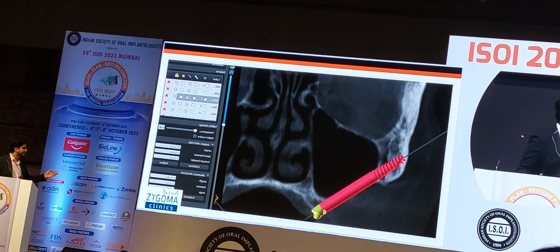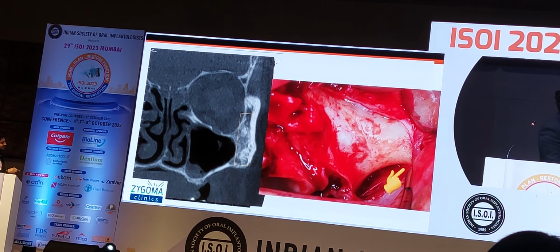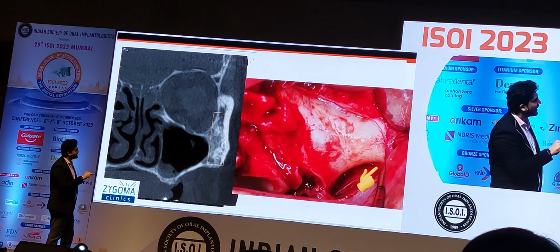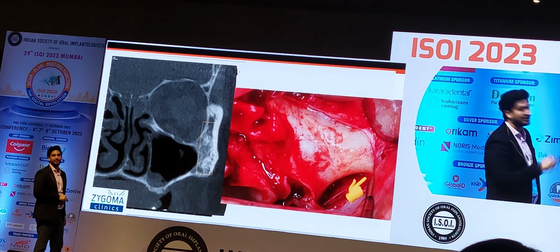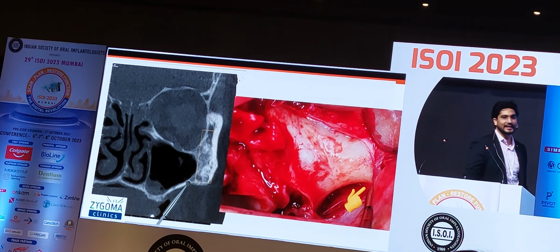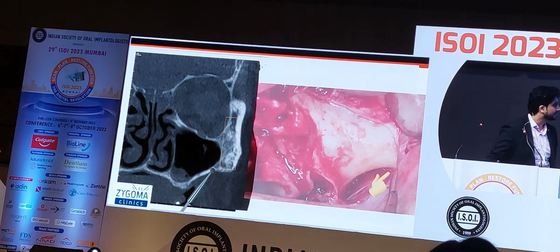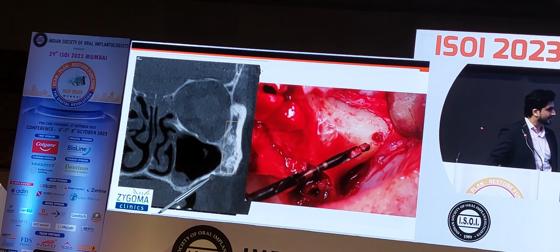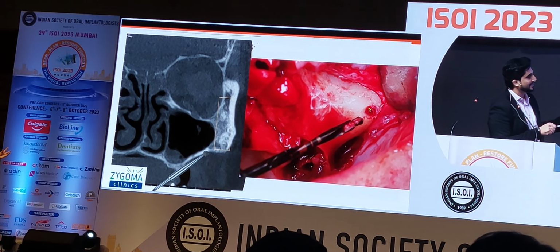So how do we do the surgery? I mean, this is the planning what you do. So this is, I always see that this is the C junction from where your arch goes posteriorly. So from this point it is 5 mm away. So this is B5. Okay, so what we do, we take the normal first burr, we make a small osteotomy at point B, using a drill, which is your pilot drill or a pterygoid drill. Why you want this? Because the diamond burr has an extension which gets engaged into it.